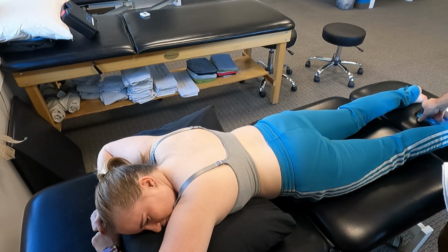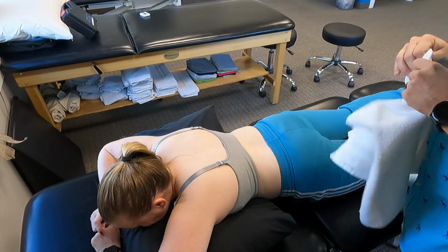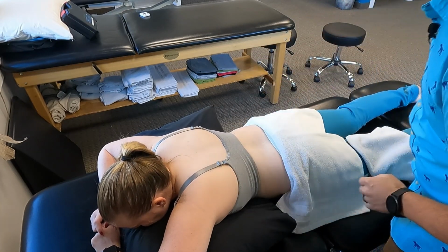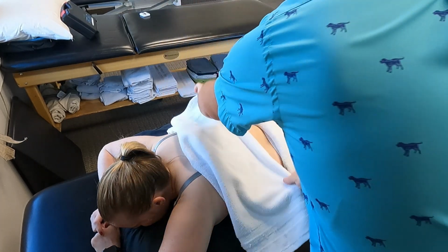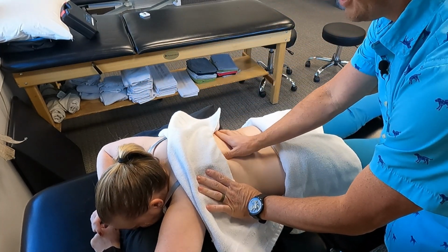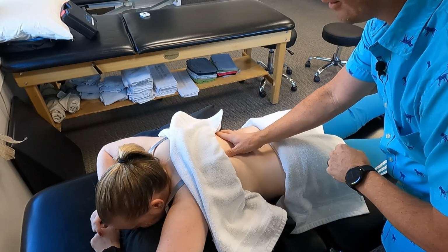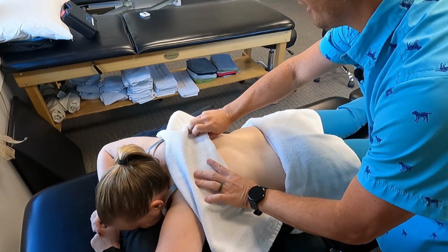Okay, so what we're going to do here, we are going to use some cocoa butter on her skin so that the tool slides a little bit better on her skin. And the area that we really want to work is right through here. Amber gets really tight right in this area of her back, right by that shoulder blade.